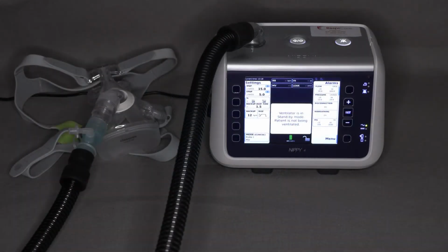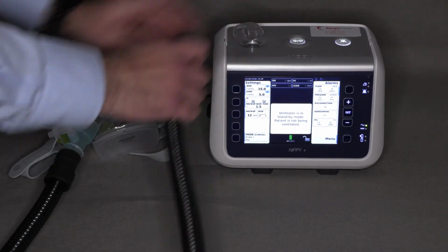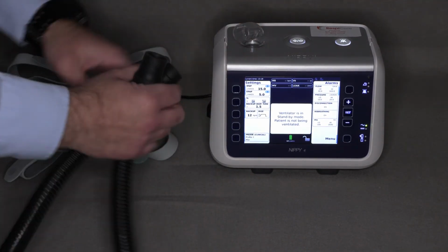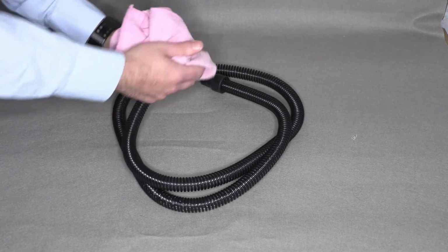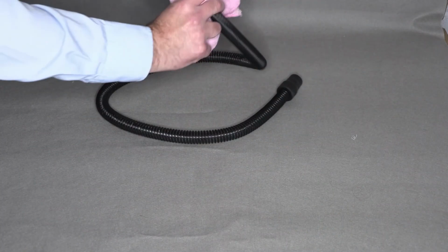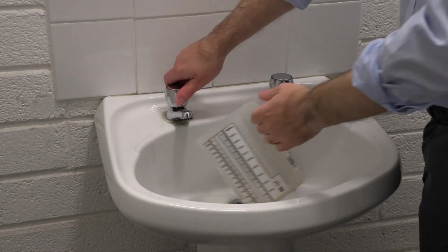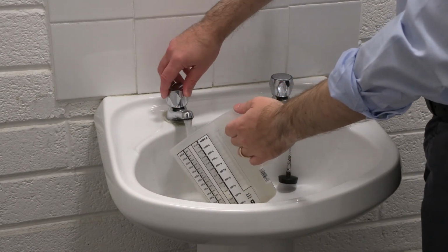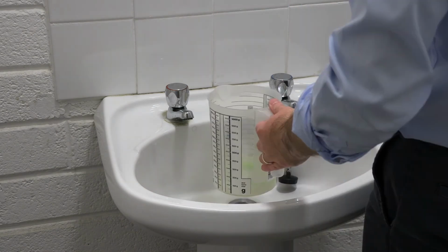Each week you'll need to clean your mask and breathing tube. To clean the breathing tube, first disconnect it from the ventilator and the mask. Wipe down the breathing tube with a soft, moistened cloth. Run some warm, soapy water through the breathing tube. Ensure that the water isn't hot, and a small amount of household washing up liquid is fine to use.